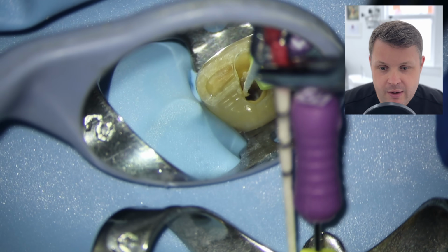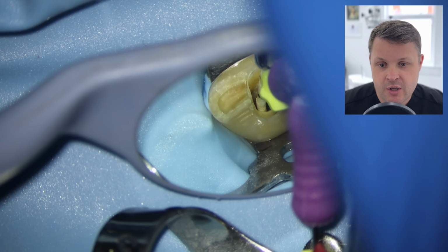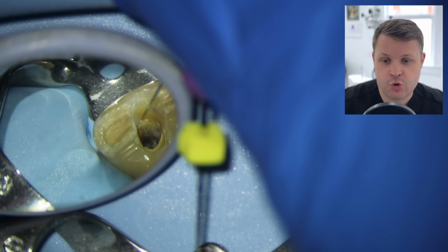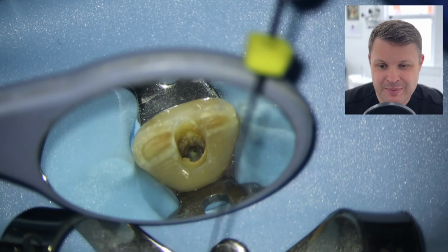I do want to wick out some of the irrigant here, because when I hook up the apex locator, I'm worried that the perforation palatally is going to short circuit this. So when I take the cone fit, the working length radiograph, it turns out that the working length is 19 millimeters.